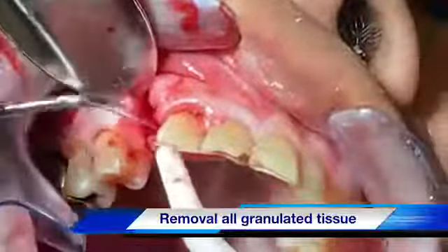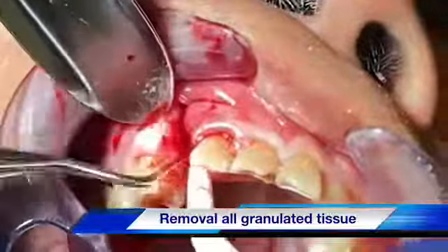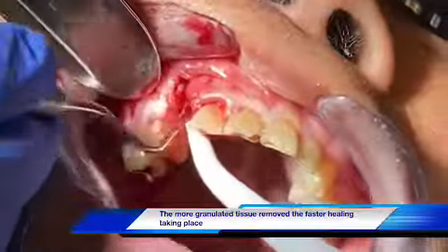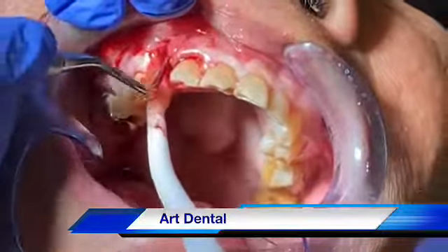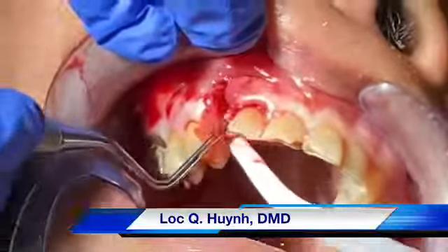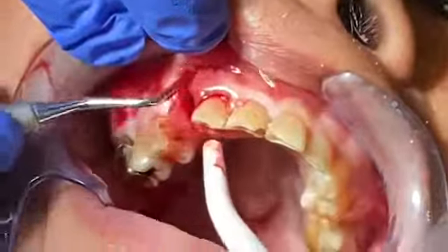The next step I will do is really remove all the granulation tissue and the infected tissue around the bone area, and make sure that I can irrigate the gum well. It will take some time because as I was working on it, I saw so much granulation tissue and it's attached to the alveolar bone. So you need time to do this.